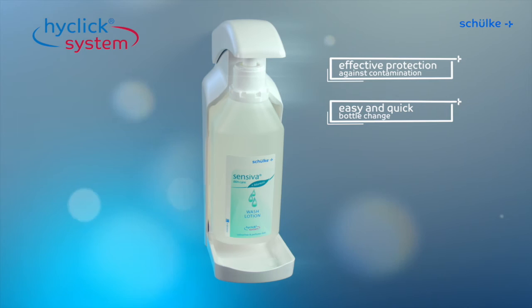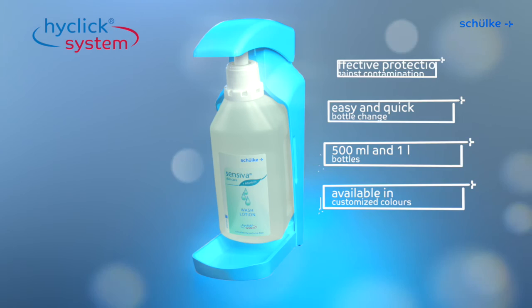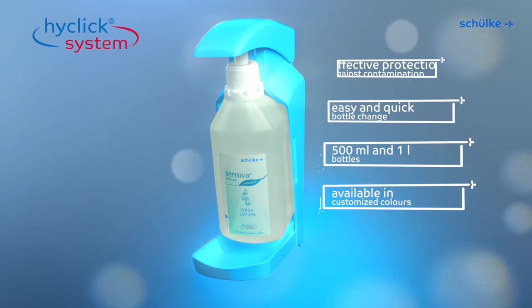Easy and quick bottle change. For 500ml and 1 litre bottles. Available in customised colours.